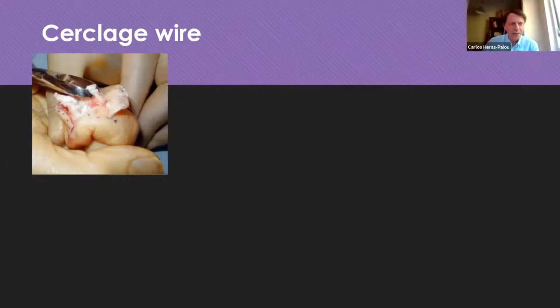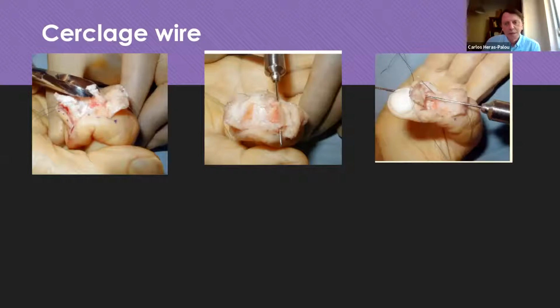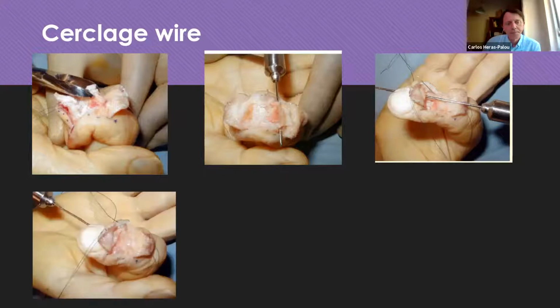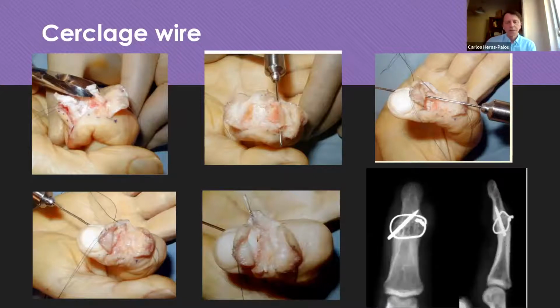It's not my preferred technique, and the reason is you need a bigger exposure for that. What you do is a dorsal H incision, and then you remove all the osteophytes. There you go. And you make two transverse holes, one in the middle phalanx, one in the distal phalanx. You pass some steel wire, and then you put an oblique K wire there. Fix it with the K wire, tighten the cerclage wire, and that's your operation.